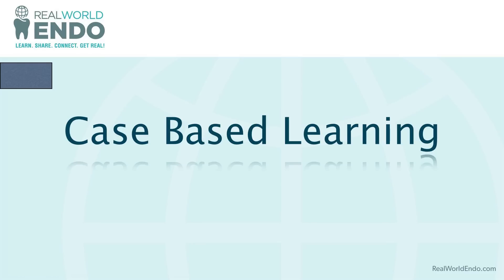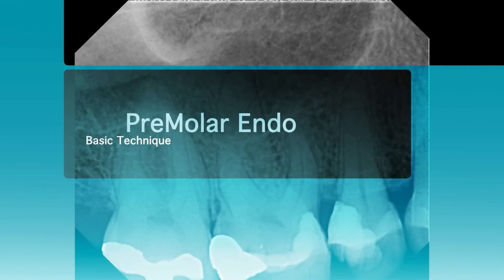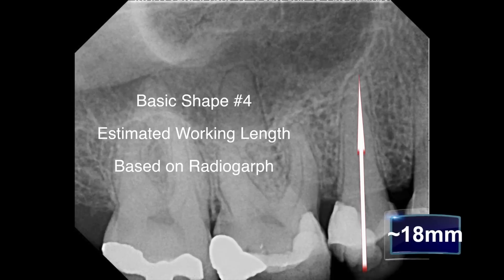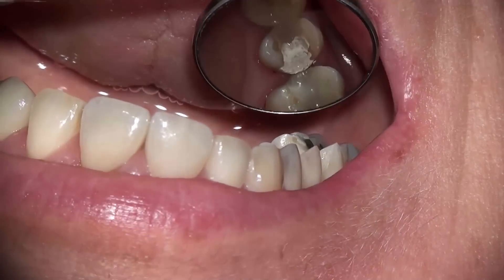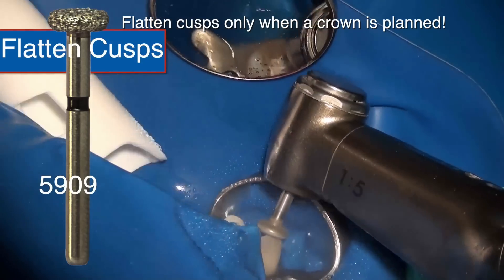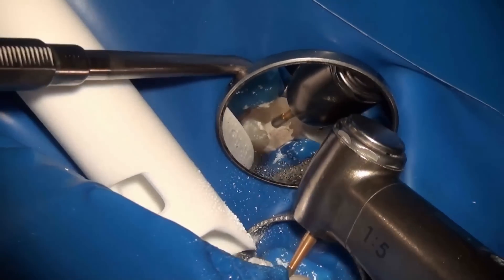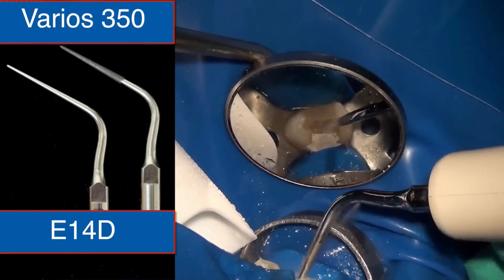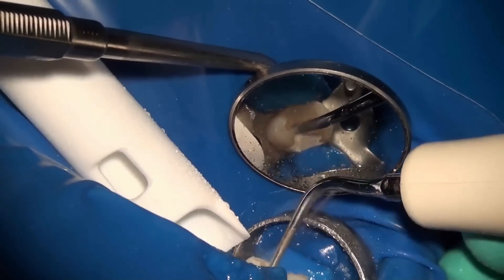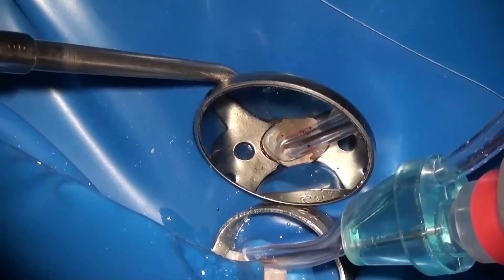Now let's use a premolar to showcase this technique. It's a fairly straightforward case — a second premolar — the kind every clinician would see in practice. I always estimate the length from the radiograph; here it's about 18 millimeters. The tooth had caries control that went into the pulp — irreversible pulpitis. I flatten the cusps to reduce occlusion postoperatively and give myself stable reference points, then use the saber cut bur from the real endo access kit for an oval outline form, followed by ultrasonic with water to remove debris.